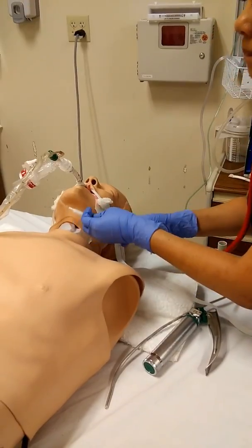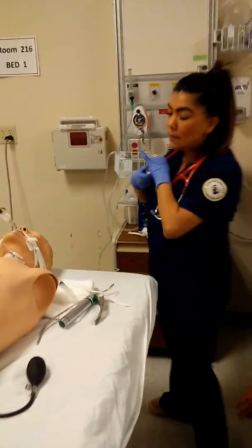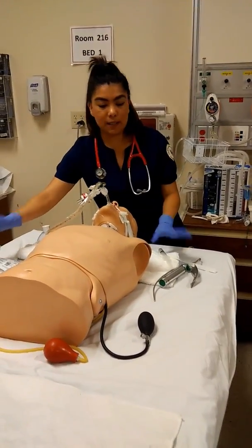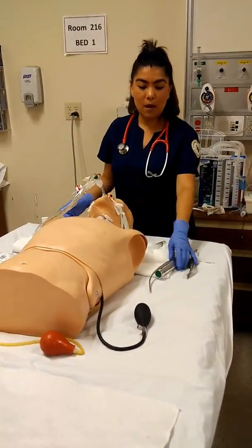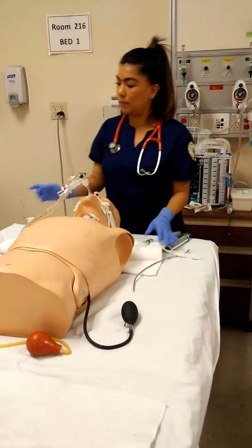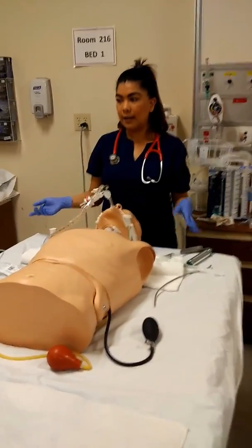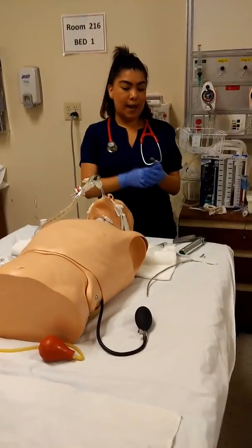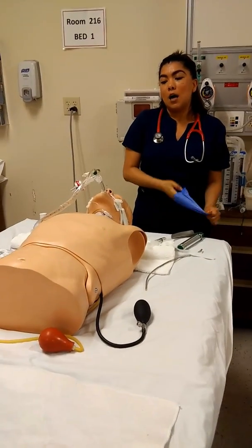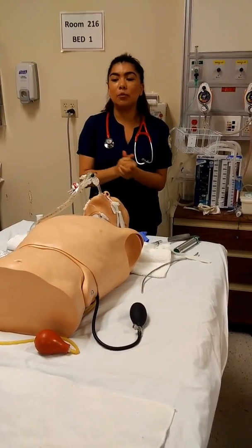Okay, so then I'm going to go ahead and gather all my equipment, dispose of it properly, make sure that we send this to get autoclaved and cleaned, the laryngoscope, and throw away any of the stuff that we no longer need. I'm going to go ahead and remove my gloves. I'm going to hand sanitize my hands. I'm going to clean my hands.